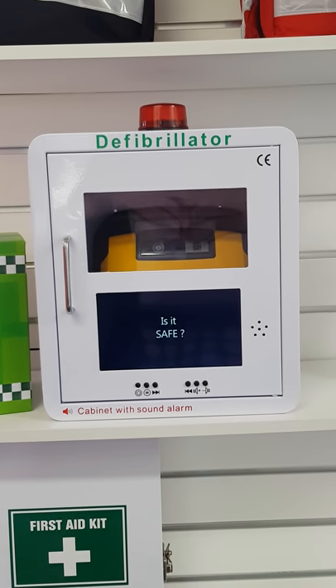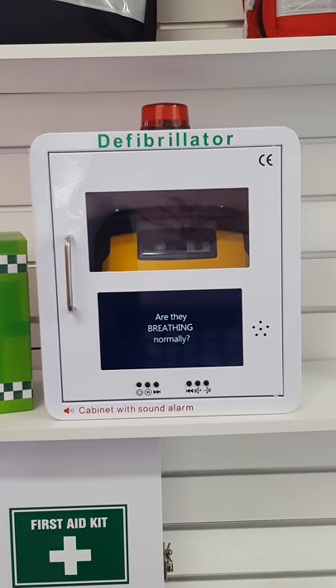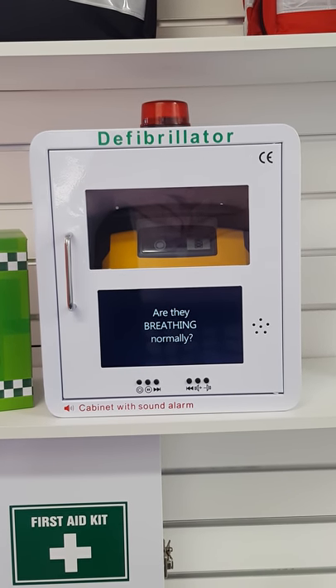Is the area safe and free of danger? Are they responding? Is the person breathing normally?